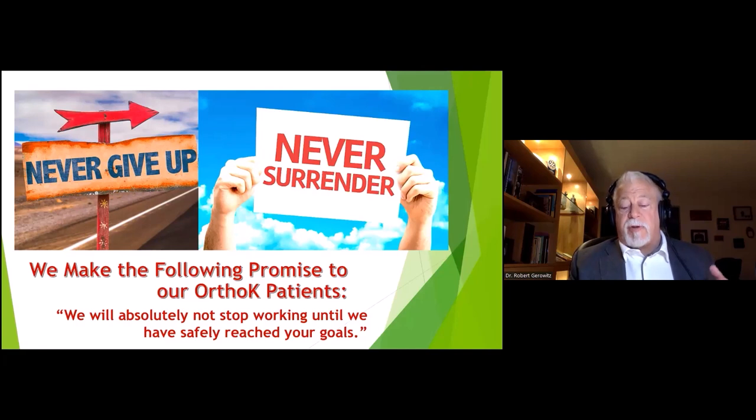Query first the patient if they're sure that their child is actually wearing their molds every night. You know, this is a kid that would never lie. If the topos don't suggest they are, ask the parent to use a pen light or their phone to check the child after insertion to see if the mold is in the right place. That is, did their kid really put them on? Or refit with an entirely different design, or wash the patient out on the chance that my original data wasn't 100% accurate and refit. Now, these options won't always work, but at least no one will question your efforts and will come to the conclusion it was a no-fault scenario.